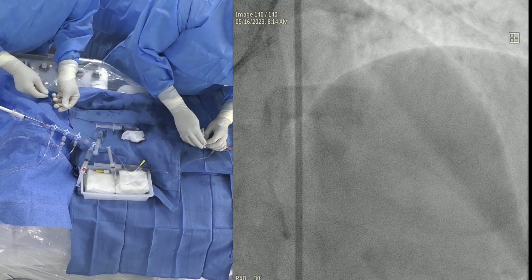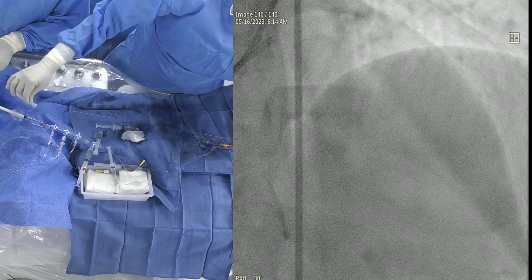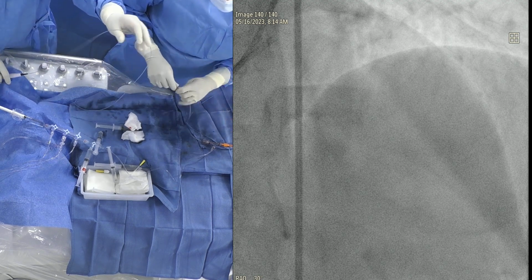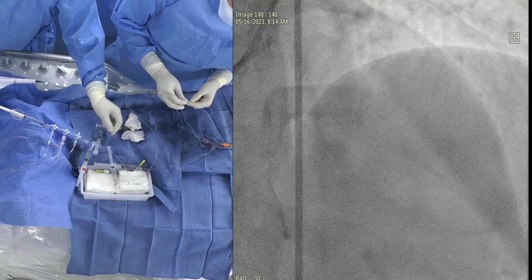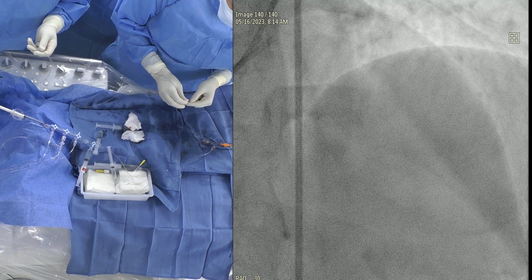So both are a little troublesome, but yes, those who are masters in interpreting IVUS during CTO PCI have this clear advantage. We have no advantage on that point, but a lot of Japanese operators do it. There was one small randomized trial that looked into it. There was no separate benefit, so only a few selected people will guide their CTO PCI with IVUS.